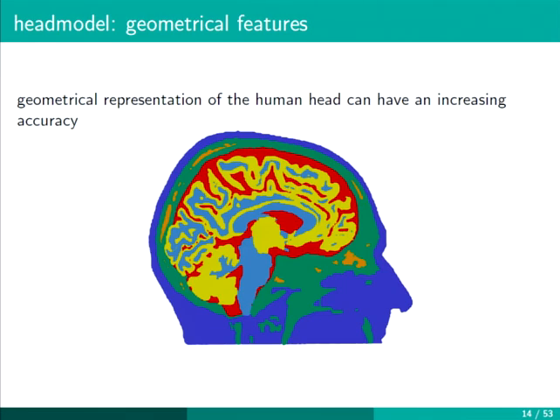For example, the skull conductivity calibration I mentioned is a procedure used in our institute, where we combine the EEG and MEG data. Maybe Sophie can explain even better, because she's working on that. We try to be very accurate in source reconstruction in epilepsy patients, so we really go for accuracy.